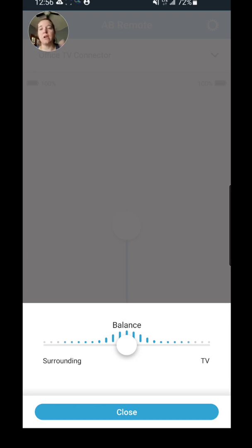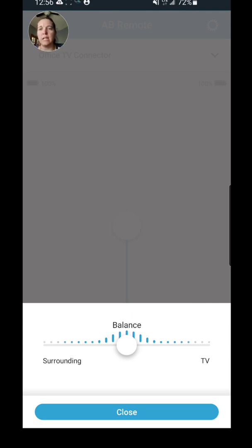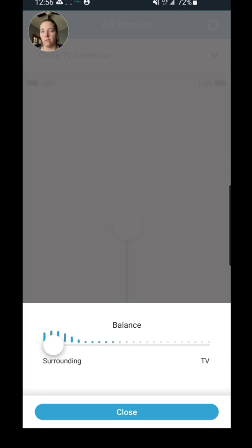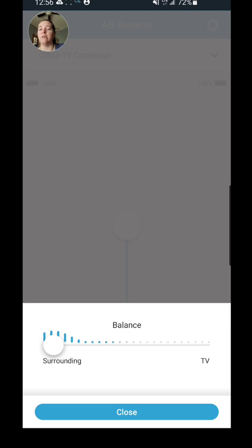Right now I'm getting about an equal amount coming from the TV Connector and from my microphones. But let's say somebody comes in and starts talking to me. I can adjust this by sliding that balance down. Now I hear nothing coming from the TV Connector and I hear all of my environment around me.